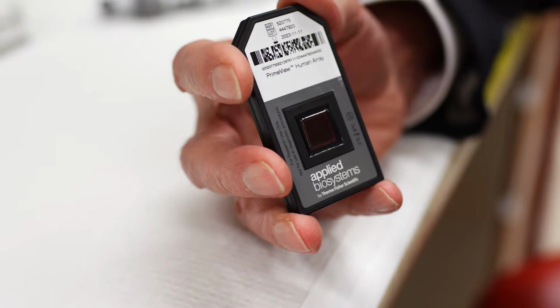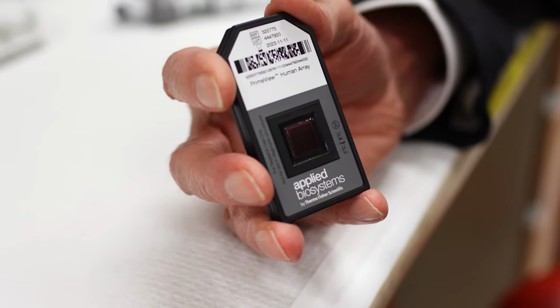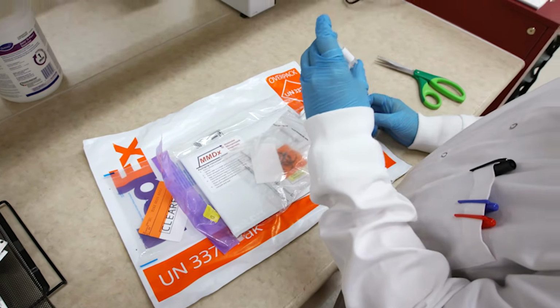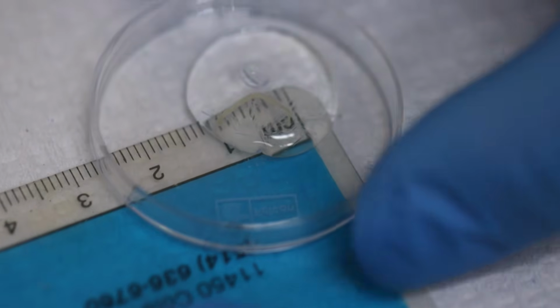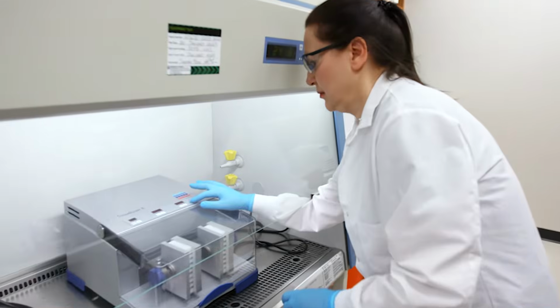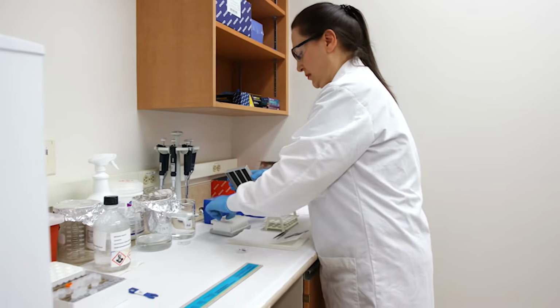So a microarray is a chip covered in 500,000 different cells in a grid pattern, and those are all mapped out so we know exactly what is on that grid. Each cell in the grid contains millions of DNA fragments stacked up. So what we do when we get the biopsy is we take the biopsy tissue, take a good look at it, and then put it into a tube with a stainless steel bead and some reagents, and then put it into a machine called a TissueLyser, which basically shakes the tube with the bead, disrupting the tissue and allowing us to access the RNA.